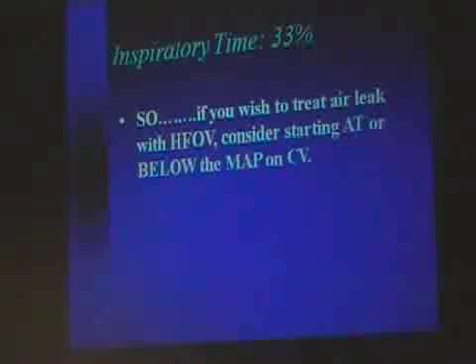Yes, Sean? If your lungs are already hyperinflated with PIE, how does the oxygenation help when you start with a low MAP compared to conventional? Don't you think jet would be preferable there? I do. I'm just saying if you want it for some reason. So I just wanted to know. It depends upon the physical properties of the lung as well.